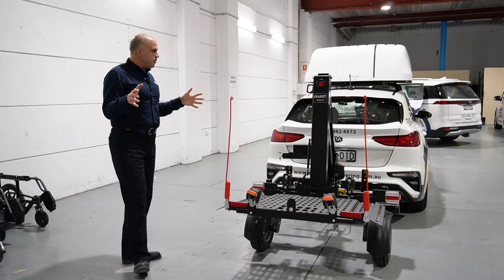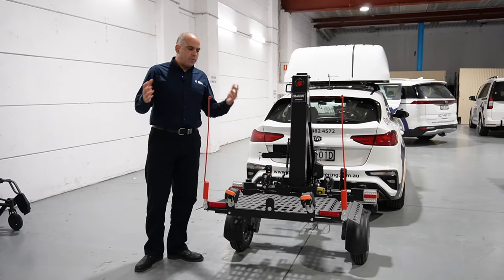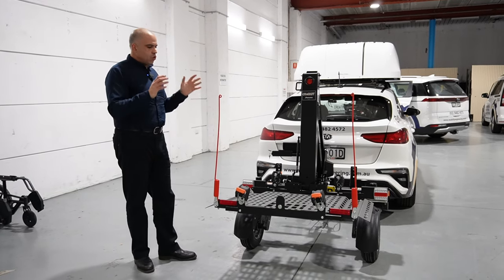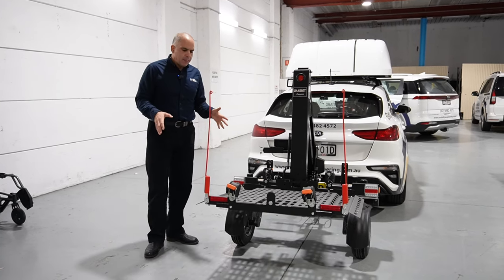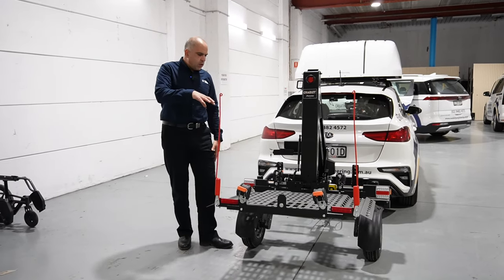Here we are today in front of our Bruno Chariot demo trailer in our Mobility Engineering Trial and Assessment Center in Hornsby, Sydney. We are here to talk about the Bruno Chariot and the trailer. The question that's come in is around the surface platform of the trailer.